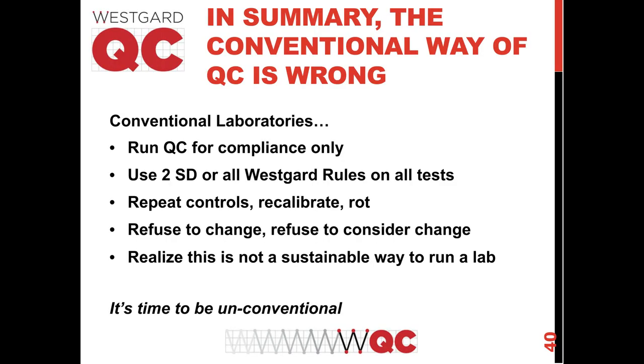So let's start to wrap up. Why did we call this unconventional QC? Because we want to break conventions. The conventional way, the common wisdom, the most common way of doing QC is you run it for compliance only, you're running the 2 SD control limits, or you're running all the Westgard rules, you're repeating controls, you're going double or nothing, or you're recalibrating, or you're feeling rotten because you have to chase all of these ghosts.